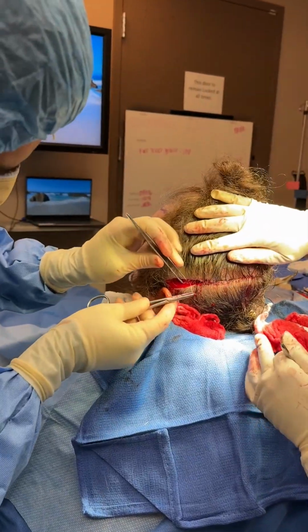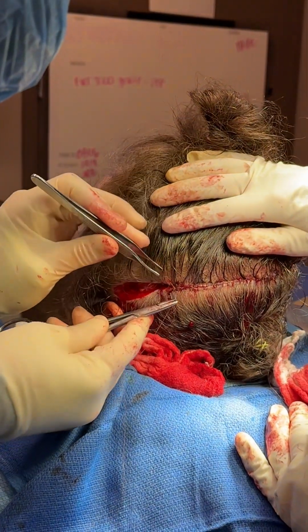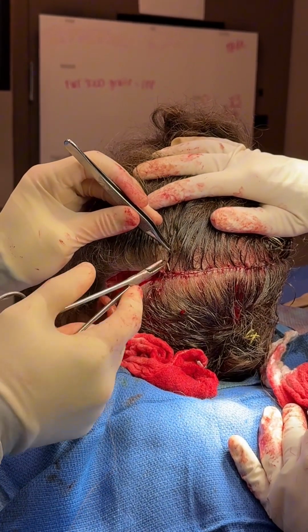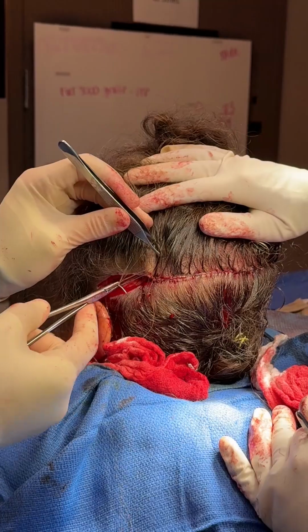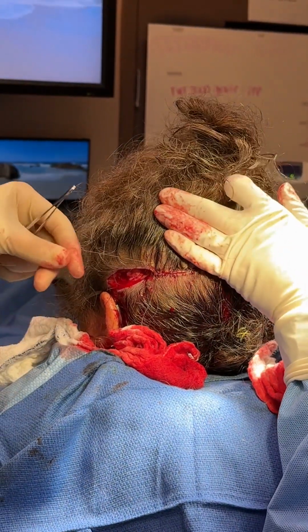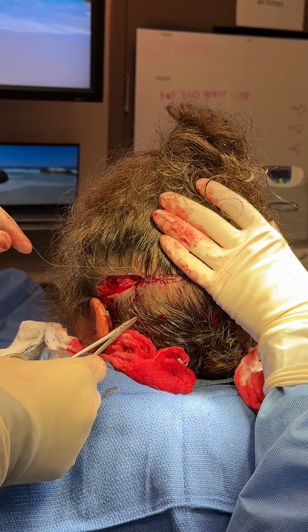All right, friends, we're finishing our suture. What we're doing is a running suture, or dissolvable suture. It's called chromic, and I feel this gives me the least scarring, gives me good support, and it's dissolvable. So you don't have to remove it, so it doesn't hurt the patient.